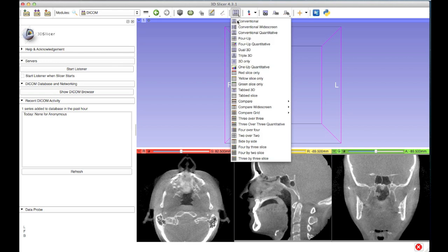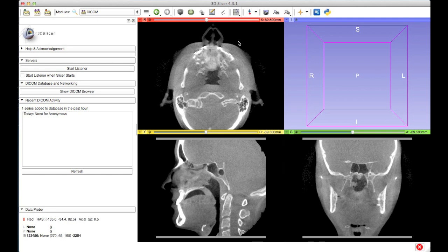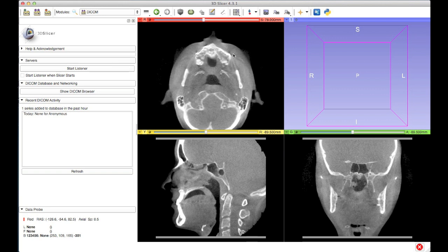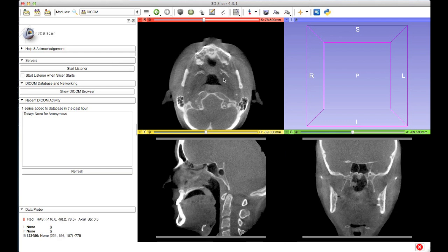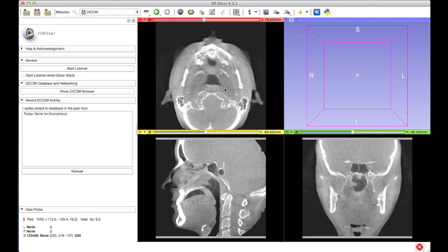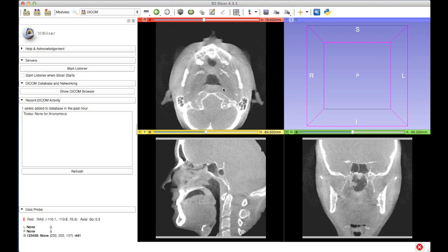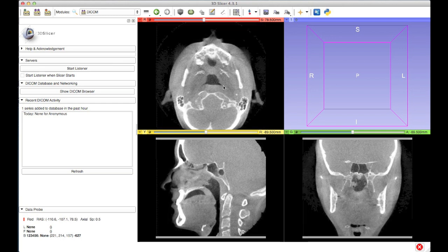I'm going to switch my layout to the 4Up view so that I can see all the slices more conveniently. I can scroll through the data using my scroll wheel or whatever scrolling option you have on your mouse or trackpad. If you're unhappy with the window leveling of the data, you can change that simply by clicking and dragging. If I do a left click and drag up and down, that changes the brightness of my data, and clicking and dragging left and right changes the contrast. I'm happy with where it is right now, so I'm going to leave it there.